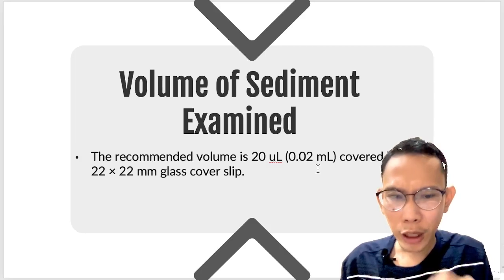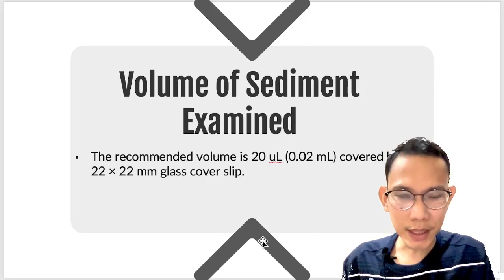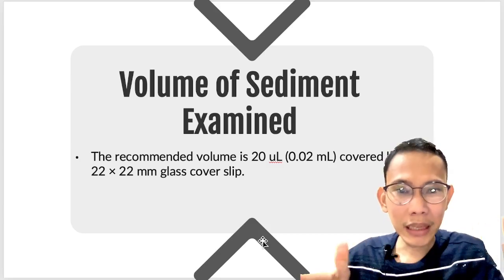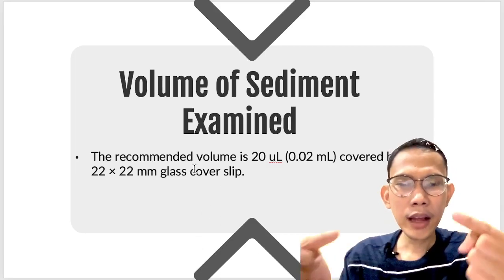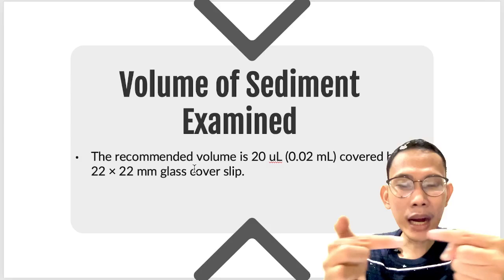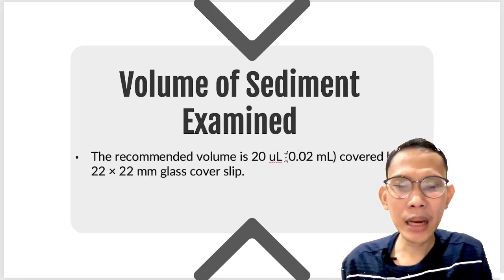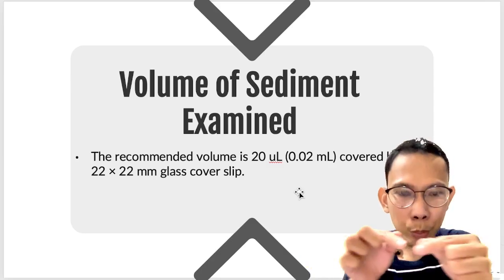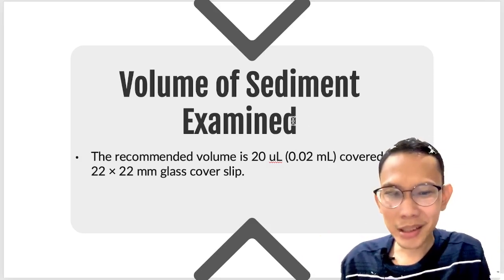Allowing the specimen, and also, hindi ko masyadong preferred magamit ng cover slip kasi ang nangyayari, pag masyadong maraming sediments kung nilagay, nasi-spread out yung mga malalaking sediments such as your cast. So, anong nangyayari? Doon pupunta sa kilid ng cover slip yung ating mga cast. So, sige lang, may experience yan, pag sobrang dami. Kaya nga, ang ideal volume lang dapat is 0.02 para hindi siya mag-exceed sa ating cover slip. Hindi siya pupunta doon sa kilid. Okay? Dapat exact amount.